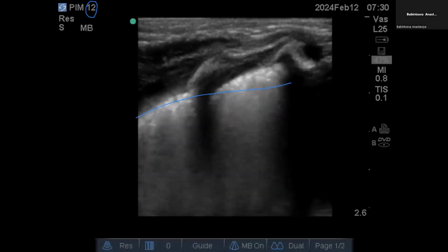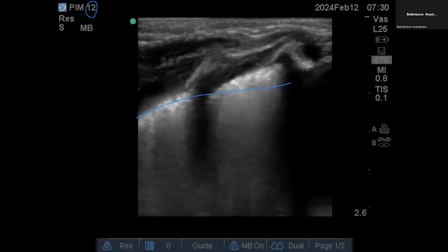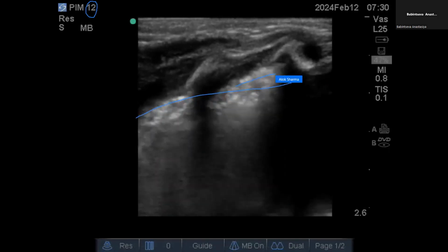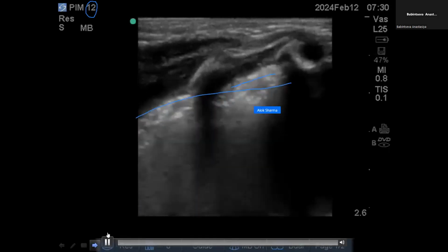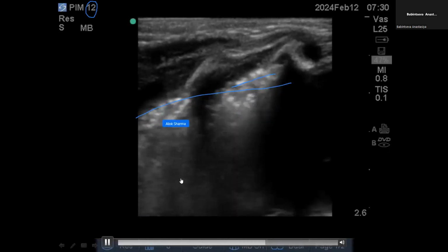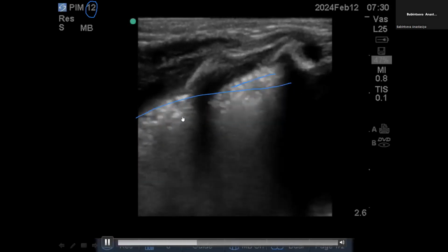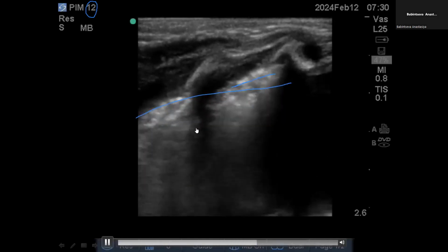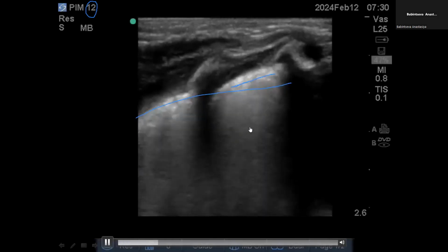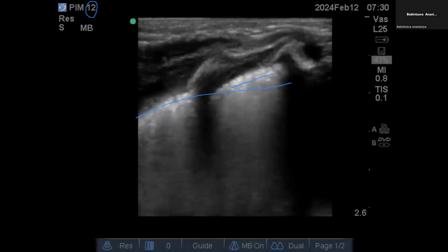So what is happening is that you have these static air bronchograms of air that remain trapped when there's atelectasis. Technically these are subpleural consolidations in this region here, but really what you see here are static air bronchograms. When the lung is atelectatic and falling away because of expiration, they're fairly decent sized static air bronchograms. Let's score it as 3 because you have atelectasis. Once you start seeing atelectasis, and as I discussed with you, clinical correlation is important.